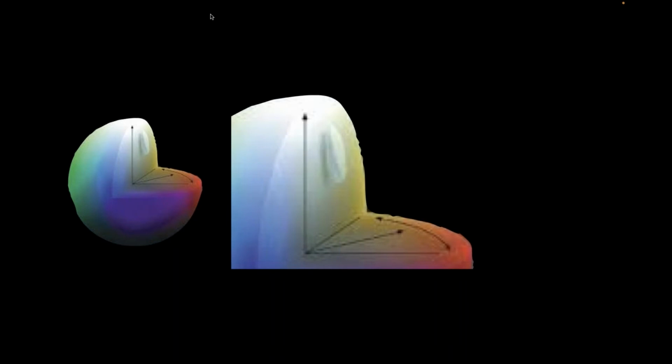And if you actually analyze that a little closer, you'll start to notice that in truth, the colors that we use in the classic guide, the standard A, B, C, and D shades, do not really fit very well into that little color space that makes up nature. You'll notice that there is some A and some B colors in there, but notice I put the B1 at the outside edge of that little circle. And the reason I've done that is because the B1 does not really fall into tooth color as we know it, neither do the C and the D. And that's why I say they do not exist in nature.